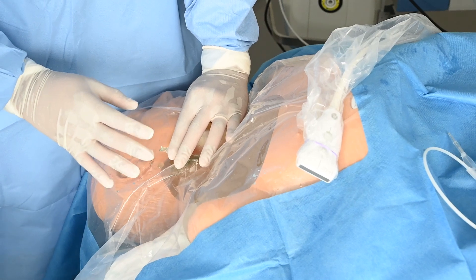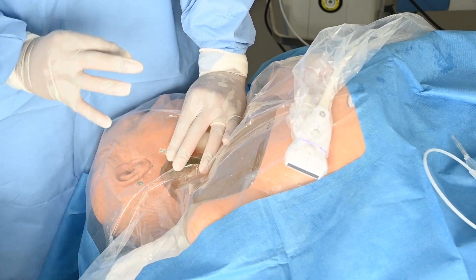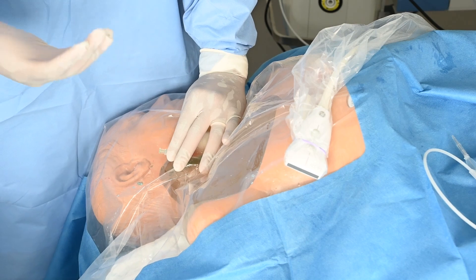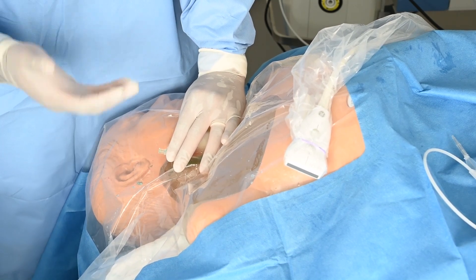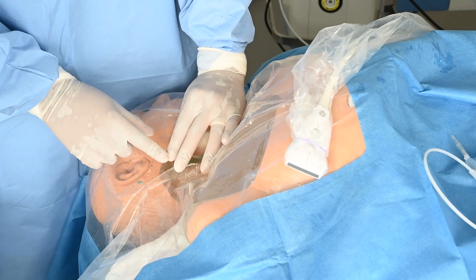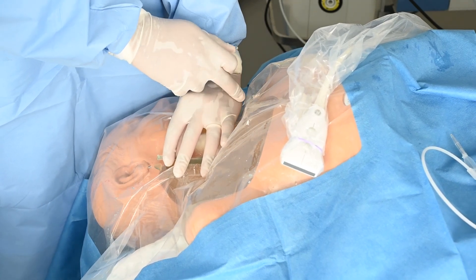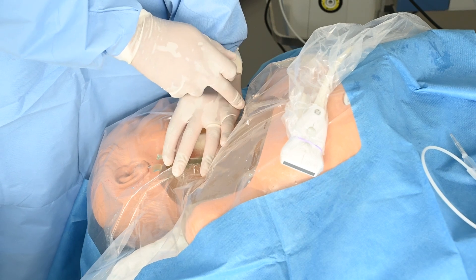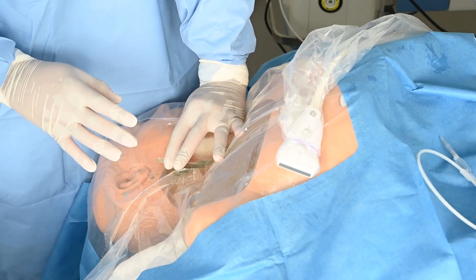So like I said, when you're anchoring your needle, you should be able to move your hand, really hit your hand, but the needle doesn't move. For those of you that have ever played pool or something like that before, it's almost as if you're making a bridge hand when you're taking a shot. So again, thumb and index finger on the needle hub, as much of the surface of your ulnar border, your hypothenar eminence on the patient with your fingers spread out. You want to create a steady base.